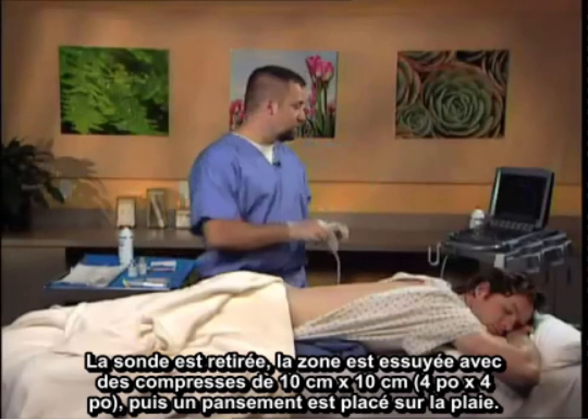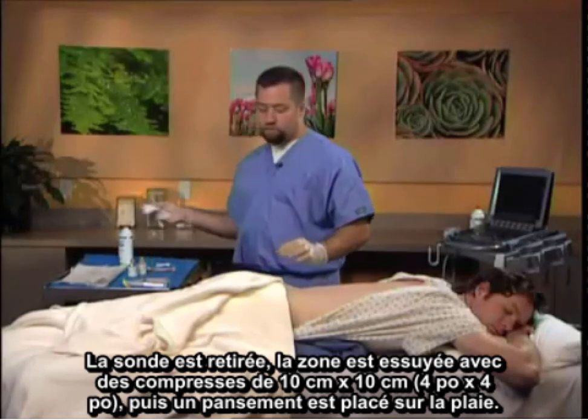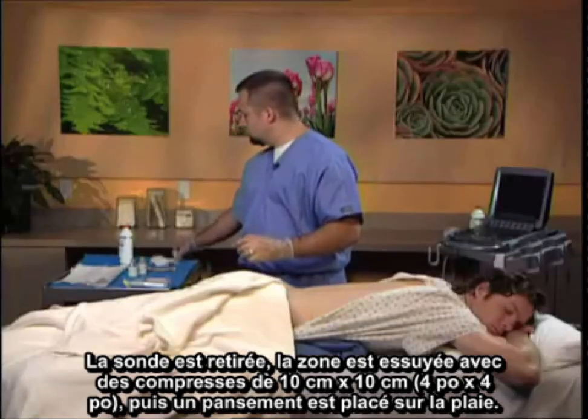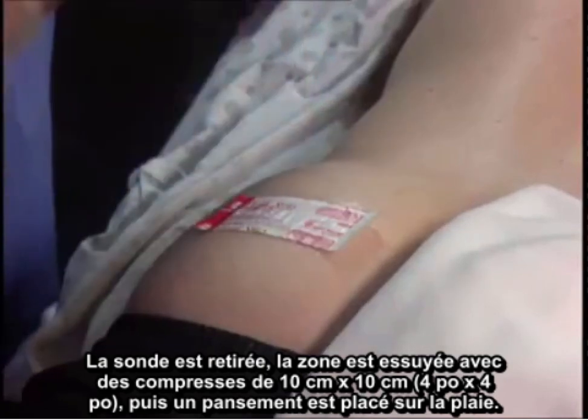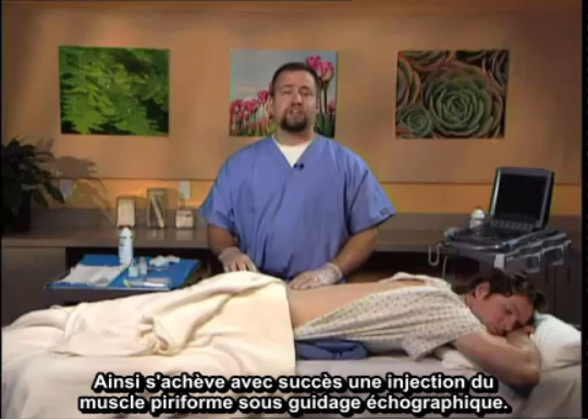The probe is withdrawn. The area is wiped with a 4x4, and then a band-aid is placed over the wound. This is the successful completion of a piriformis injection under ultrasonographic guidance.